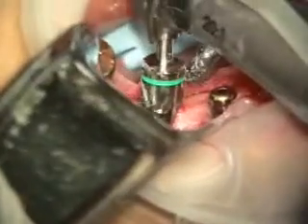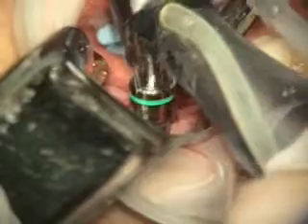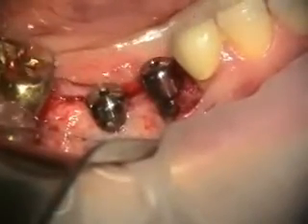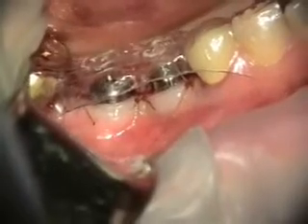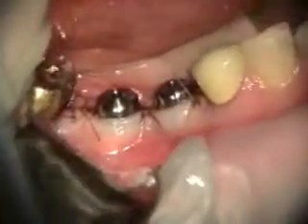We're doing a 4.5 now. So there are our two implants and we'll do the suturing. That's our final suturing. Let's see our stent in place and we'll take a look at it in a few weeks.